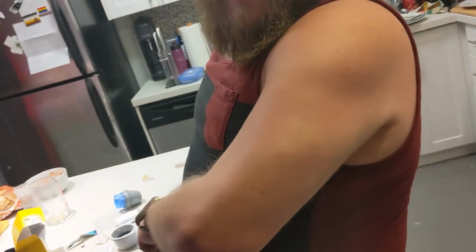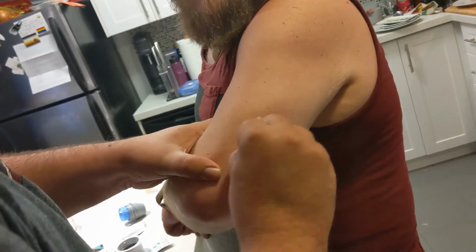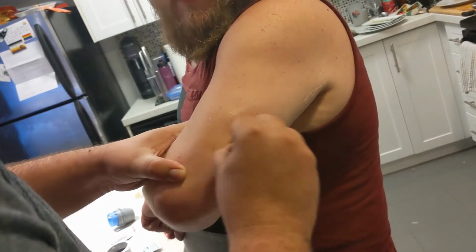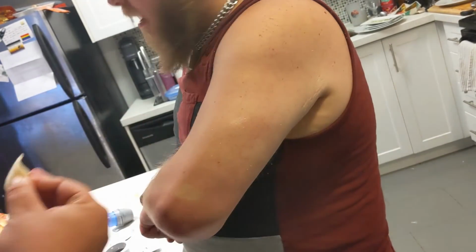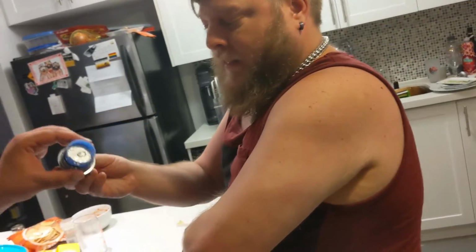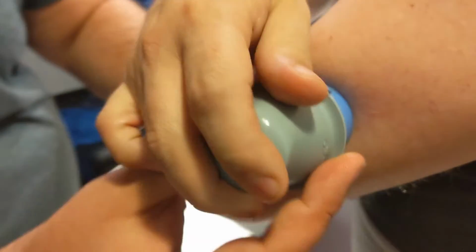So as I was saying about the skin tack, if you're using this, make sure you try to touch it with your fingers as little as possible because it is super, super sticky. So you don't want to be manhandling the swab. Okay, so I think we're ready. You want me to line it up for you where I put the needle on? Yeah, he's gonna line it up and then I'm gonna push it in. Go for it.